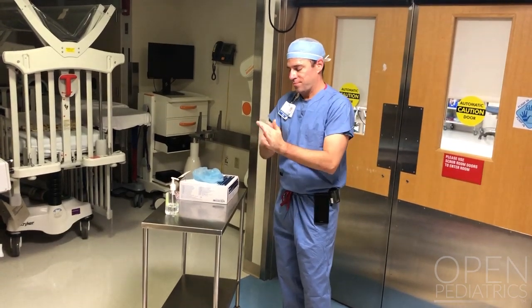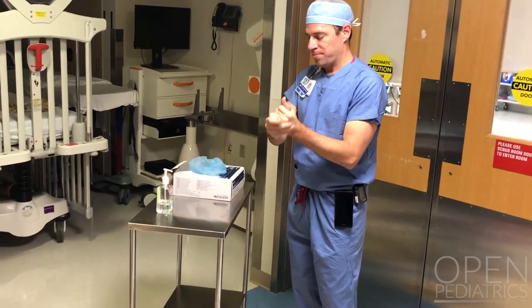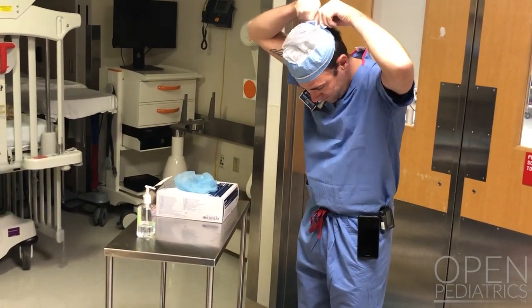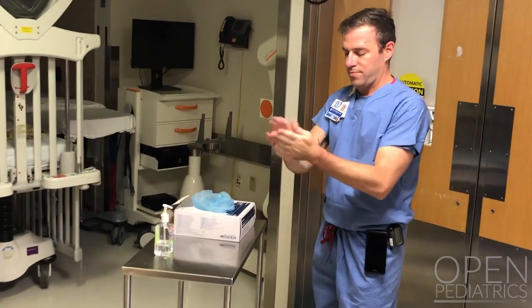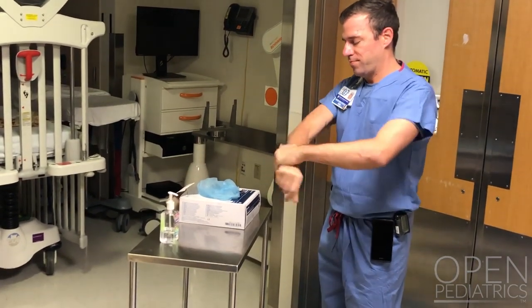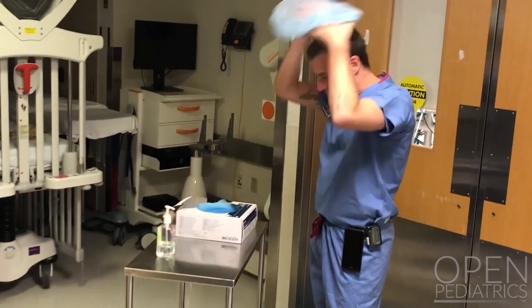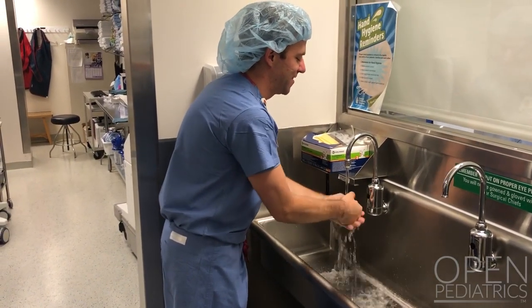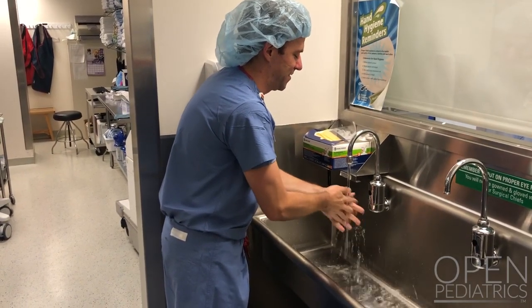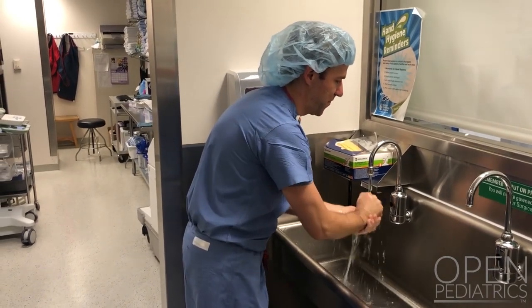We've added a step because we're in the operating room and have the added PPE of a surgical cap. So in this circumstance, even though you're in the operating room, remove your cap, perform hand hygiene, and place another surgical cap. Once your PPE is successfully doffed and you've performed hand hygiene and placed another surgical cap, you can go to one of the scrub sinks and perform hand hygiene with soap and water for at least 30 seconds.